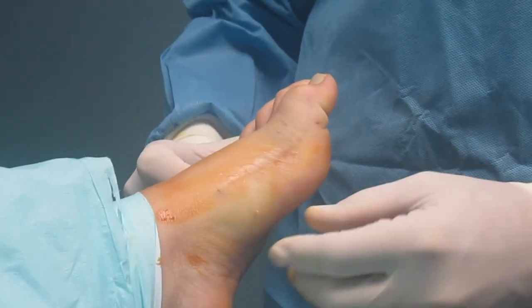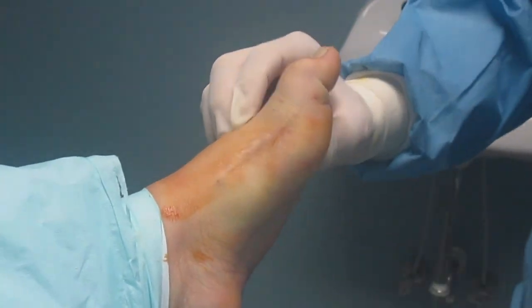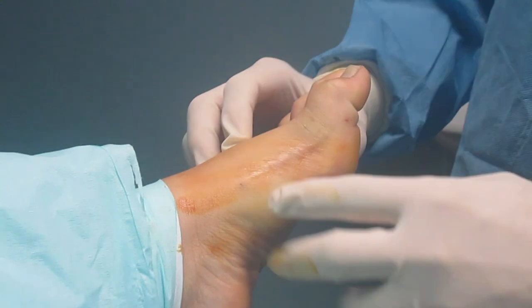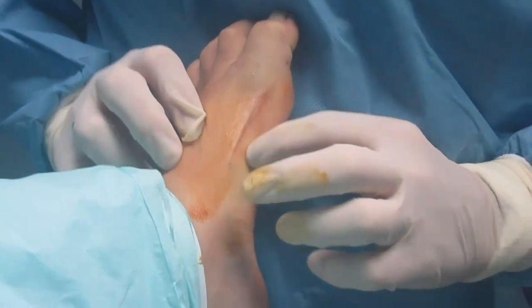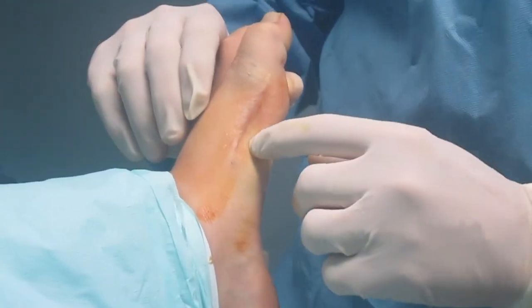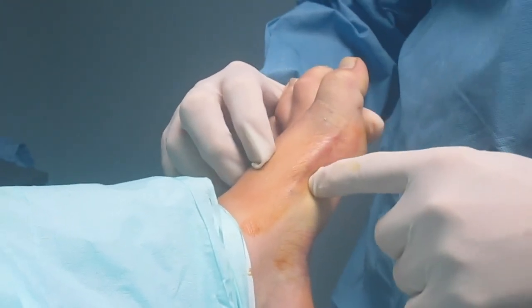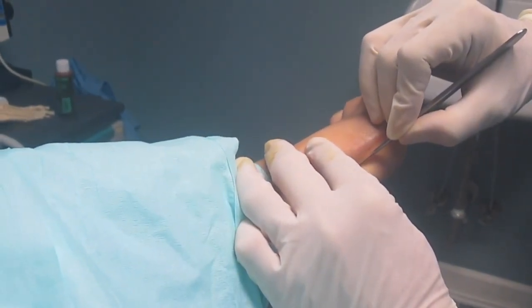Okay, here we are. We're going to correct this Hallux Varus issue with minimally invasive surgery. First part of the procedure we want to do is address transecting our abductor hallucis muscle tendon here. And most of these patients, this will be tight. If you bow the foot, you can actually palpate that tendon fairly easy. And it sometimes can be kind of far down. If you have trouble locating it, when the patient's standing, you can actually mark it ahead of time. But it's right there. I can feel it like that. So I'm going to make a small incision right there. And this is just through the skin.